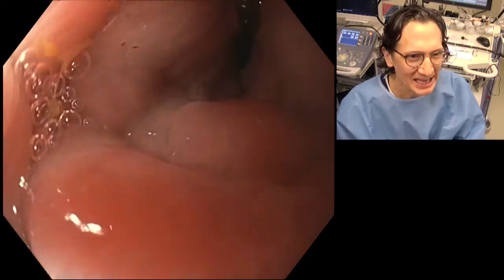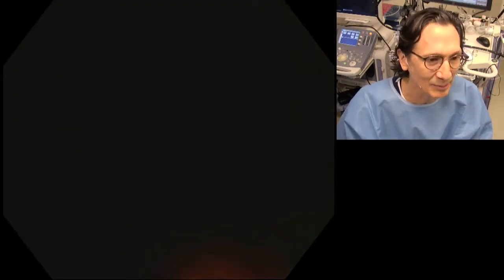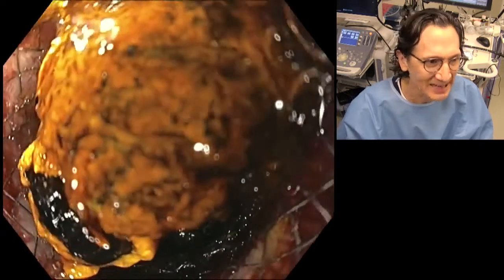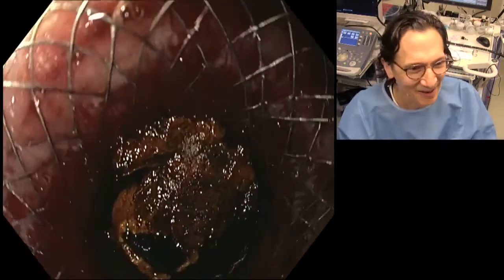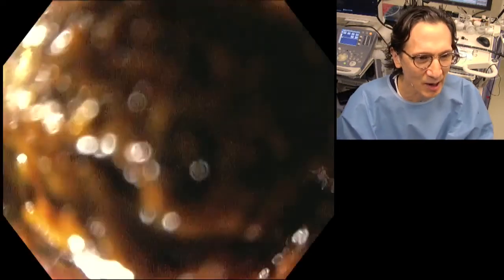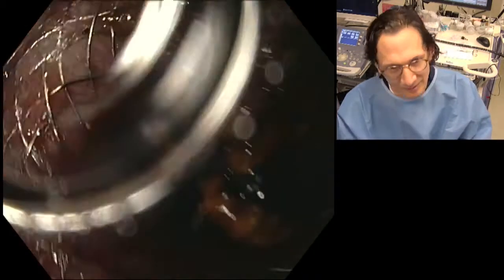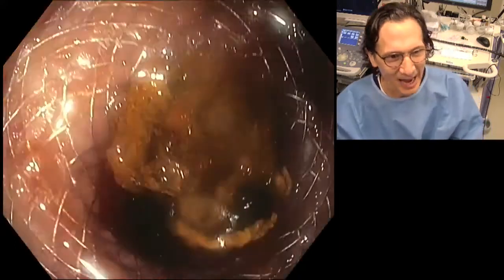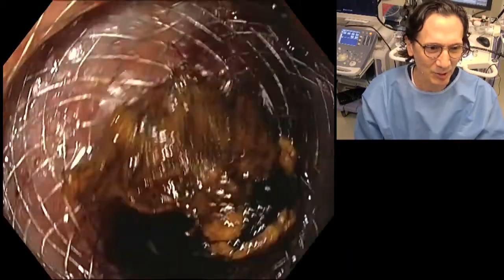and what we've done here, if you think about it, is we have just created an alternative pathway for the bile to drain. That's all, and that's where the bile normally goes. It goes in the duodenum, right? So we've actually remained as faithful as we can to the original master plan, the original blueprint of how it was created, which, after all, is why all of us went into medicine, right? Because we all were just so amazed at how this body of ours works, of all living beings, works so miraculously. So now I'm starting to sound like a preacher or something. So I think I'll end here, and we'll go to our next case.